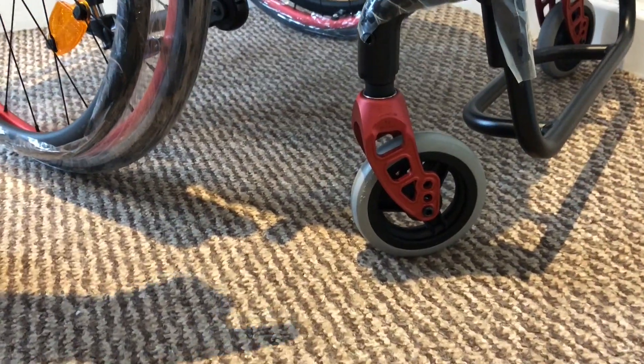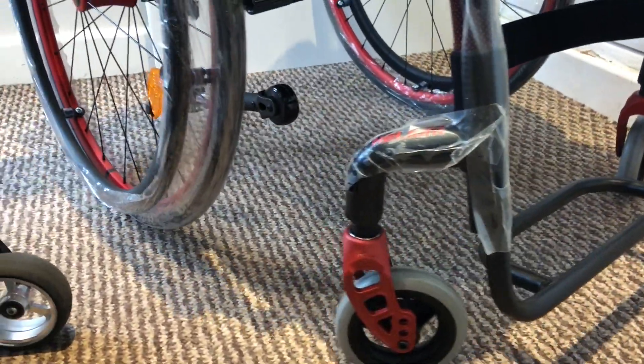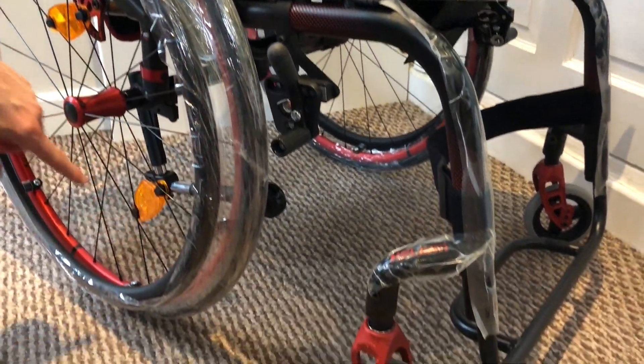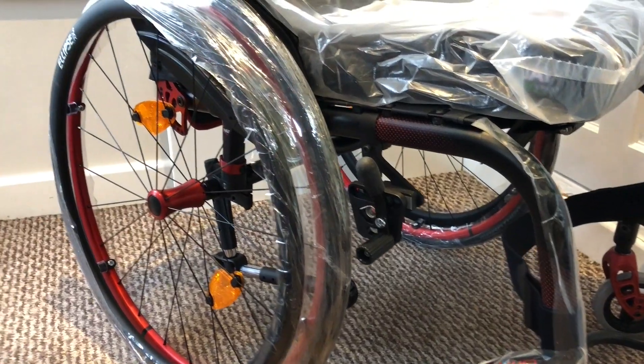They're all the same colour which is a great feature. It comes with the red dots so it really matches in with the caster wheels and the rims with the red dots.